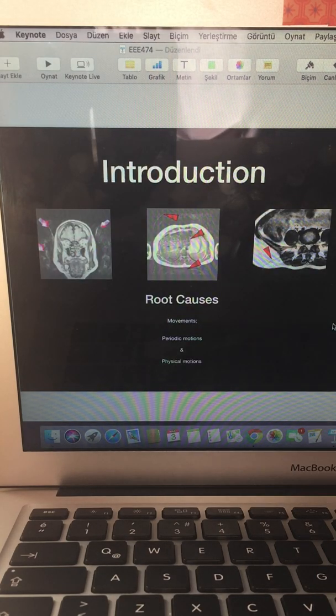As a brief explanation about ghost artifacts, they show up in the original magnetic resonance image while they shouldn't exist. Thus, they decrease the quality of the image, so they may produce very problematic results in illness detection. This is why it is significant to get rid of that problem.